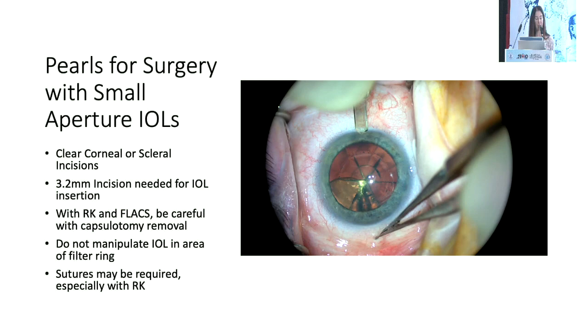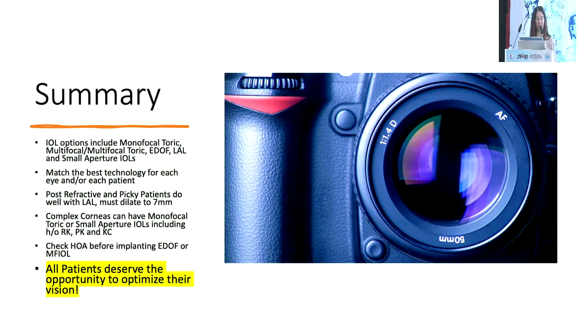If you're using FLACS with RK, you need to be careful about your capsulotomy removal because of the discontinuities that there can be in the capsule. However, it is still quite easy to remove. And in summary, all patients deserve the opportunity to optimize their vision, even if they have corneal pathology. Thank you.